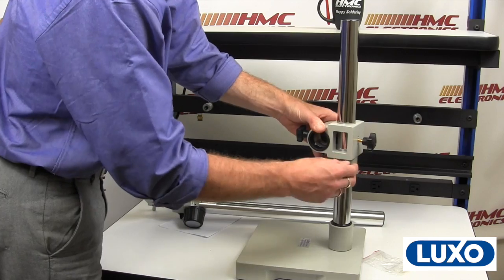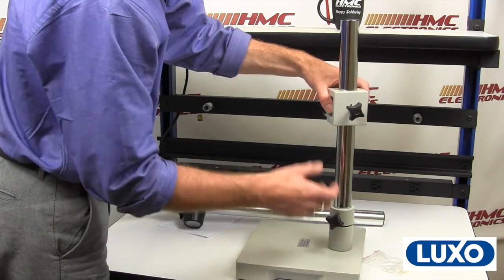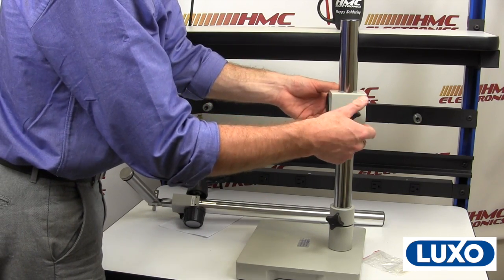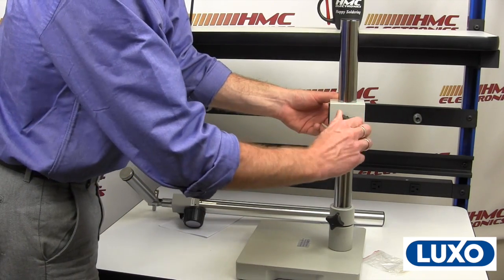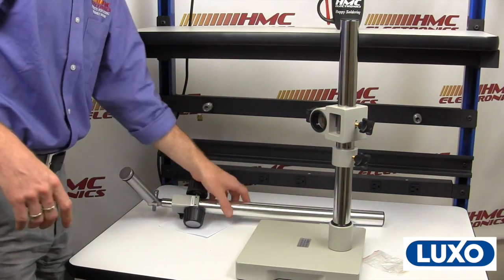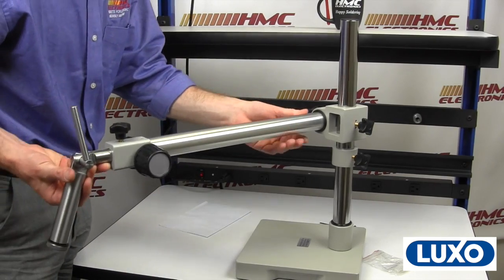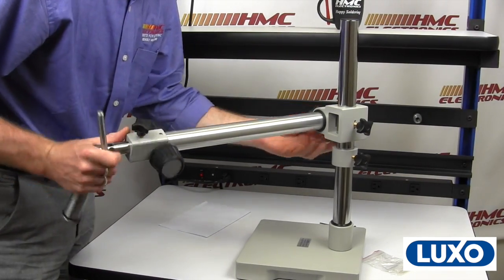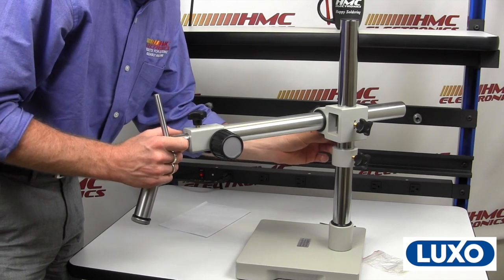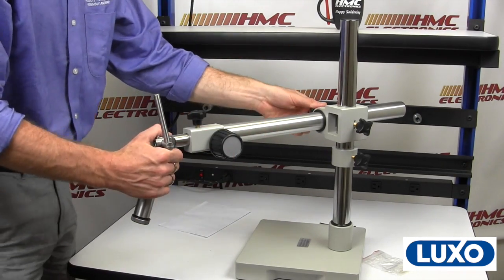The importance of this collar cannot be expressed enough. In setting up your microscope, you're going to need to do some vertical adjustment. If you don't attach this, or if you just leave it down here, and your operator is not aware of the weight of this horizontal bar and the microscope on it — as soon as they loosen this off, it's going to come crashing down. So your locking collar should always be very close to your cross block. Why does that little silver nut need to go on the bottom? There's a little groove right here. You push this in, and that little threaded screw goes nicely into that groove, keeping everything nice and vertical and in place.